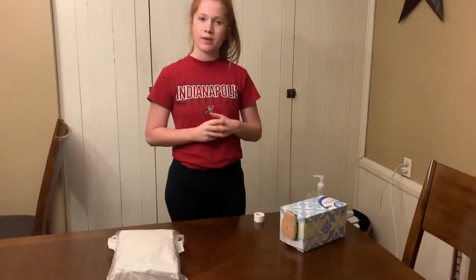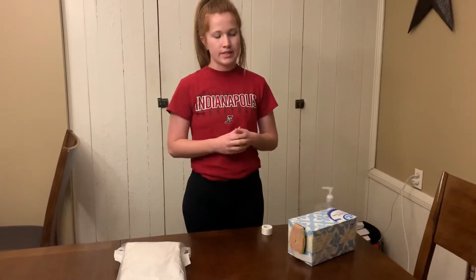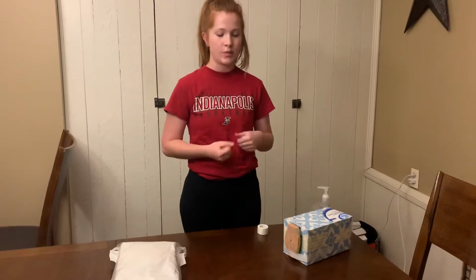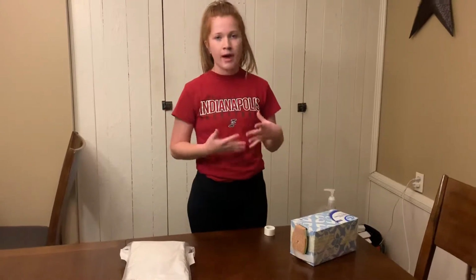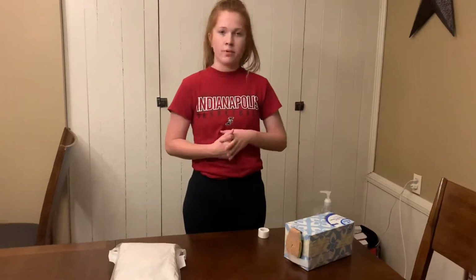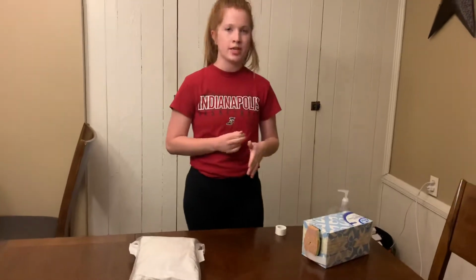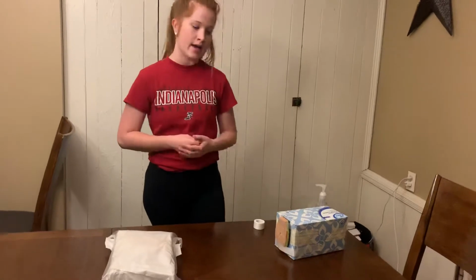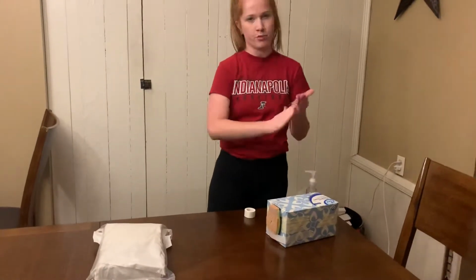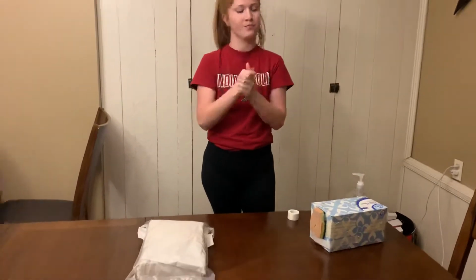Then I'm going to go ahead and explain the procedure to the patient, just letting them know that I'm placing an indwelling catheter, that they're having difficulty voiding, and that this will help to drain their bladder. I will also let them know that to cooperate, I'll need them to lay still on their back, and that it may be slightly uncomfortable, but it'll be a quick procedure, and they'll feel a lot better once it is finished. I would also assess the patient for bladder distension and fullness, which would indicate them needing that catheter. When I entered the room, I should have performed hand hygiene. So I'll do that now.